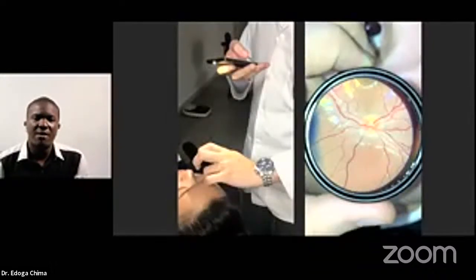So you have a problem of being able to mind the lens eye distance, at the same time mind the lens phone distance. And you have to move these two together in synchrony.